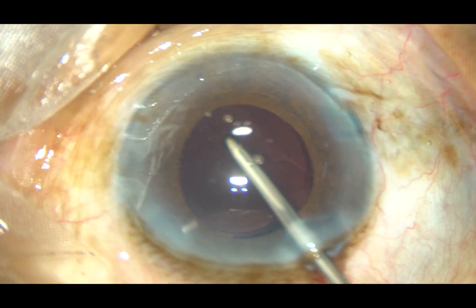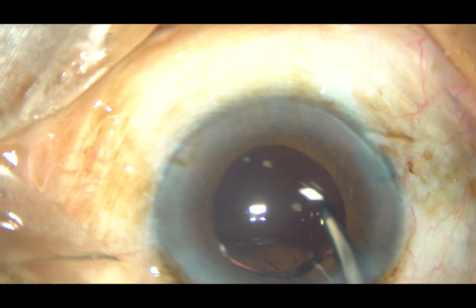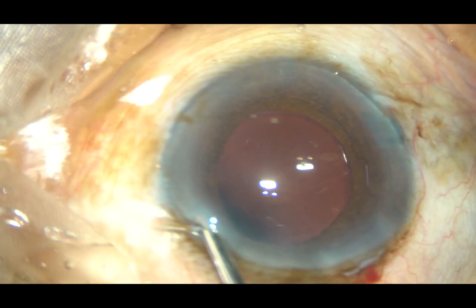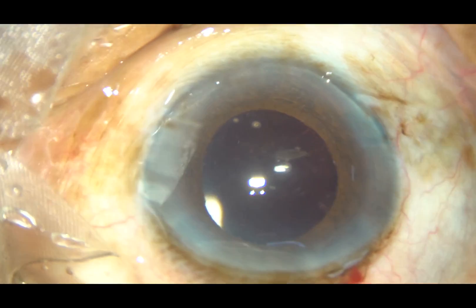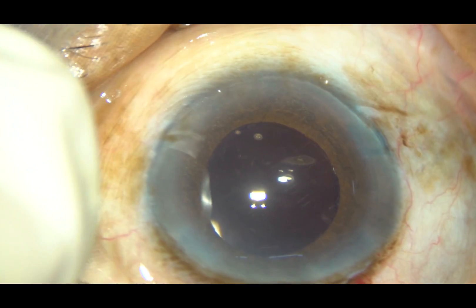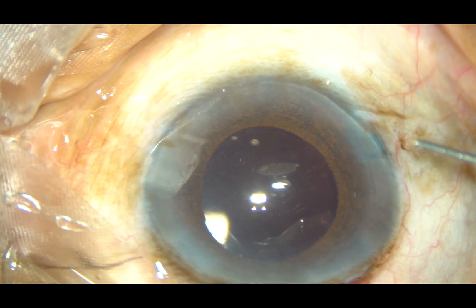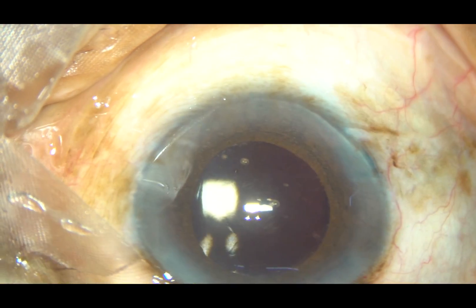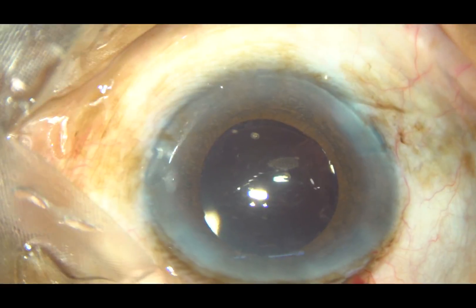So, in this case we have seen a white homogeneous sheet of epinucleus — degenerated epinucleus. This is the sign of hypermature sclerotic cataract. In hypermature morgagnian cataract, as soon as you make a puncture onto the anterior capsule, milky fluid comes out, which you have to aspirate to see clearly. But in hypermature sclerotic cataract, there is no milky fluid, but the epinucleus has degenerated into a white homogeneous sheet.